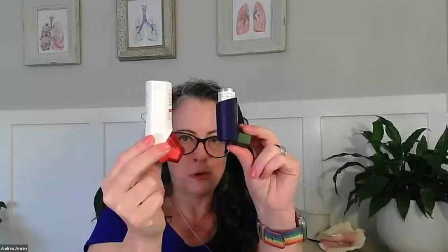The other thing I wanted to mention, I know everyone's different, as I mentioned, and everybody does medication differently. So this is one that I mentioned at the very beginning. That's one of the albuterol inhalers. I mentioned it's a little bit chunkier than a normal inhaler, because it's a dry powder inhaler. So I know a lot of people really struggle, myself included. I cannot use this when I'm having an asthma attack. I can't inhale enough. I'm usually coughing so hard I'm trying not to throw up. This isn't going to work for me. And so, like I said, everybody's different. So make sure that you're using the one that works for you.